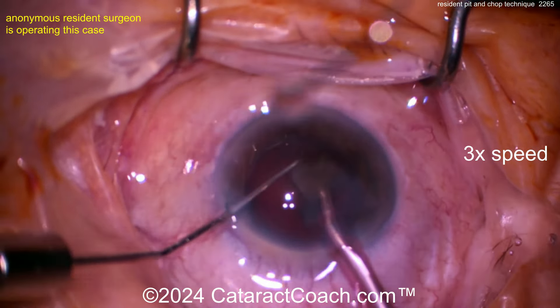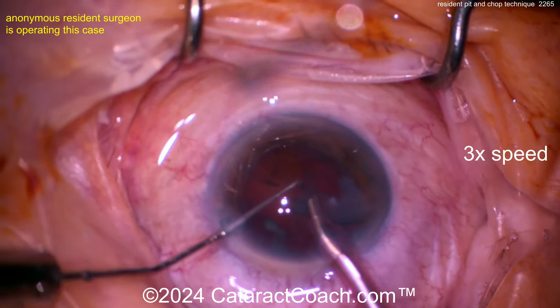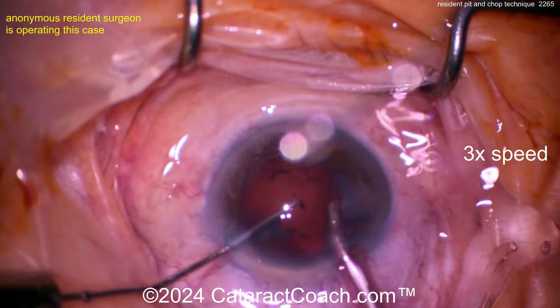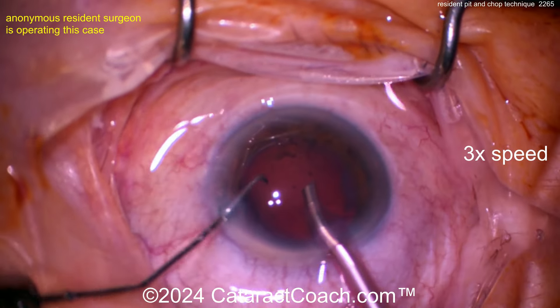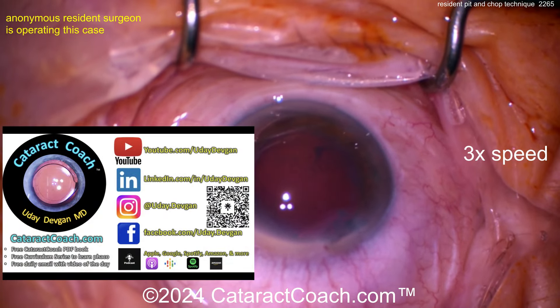You can see how efficient this is — all these pieces coming down. This patient is going to have a beautifully clear cornea the next day. This is one of the magical things in ophthalmology. What's the pre-op vision? Hand motion, or maybe wind of perception if you move your hand fast enough. And the post-op vision is going to be great — 20/20, 6/6.